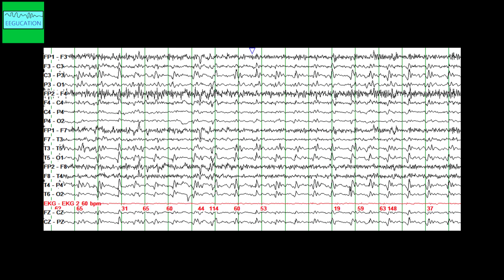This is an EEG of a patient in his 60s who had rapidly progressive dementia. On clinical examination, the patient also had startle myoclonus. If you look at this EEG carefully, you see these periodic discharges occurring every one second. In the right clinical context — rapidly progressive dementia with appropriate imaging findings — and if the patient has clinical findings suggestive of CJD and you get this EEG pattern, it is very supportive of the diagnosis.